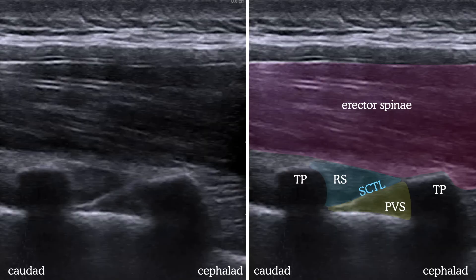This is where you want to deposit the local anesthetic. With a lateral tilt you're often catching the rib over the lateral PV space, and sometimes you can see both the rib and TP simultaneously. Slide your probe medially until you lose the pleura, then tilt back just enough to bring it into view. Note also that the most cephalad bit of pleura appears deeper — that's because local anesthetic has already been deposited there and the pleura has been depressed.